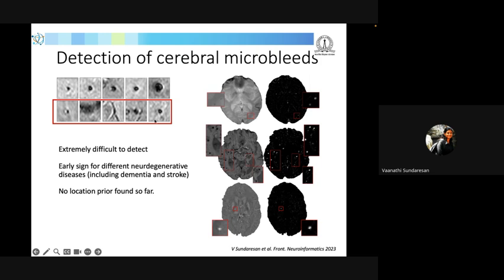These are part of sulci. So basically, on top of these structures being small, they have a lot of false positives in the image. This makes it a very challenging task, but detecting them at this stage is very beneficial because they are one of the excellent biomarkers for stroke and hemorrhage.